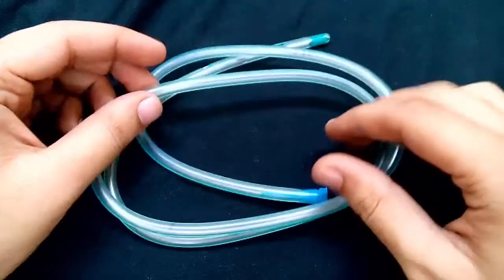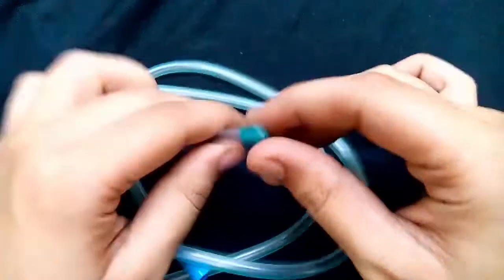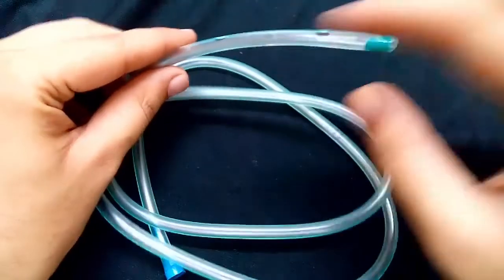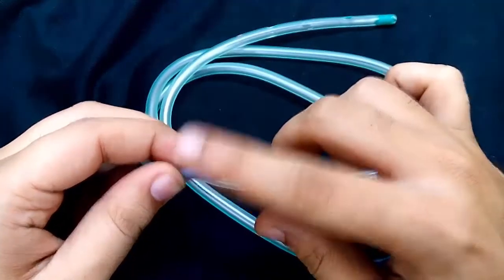There are different parts of the Riles tube. This is the tip of the Riles tube, this is the body, and this is the base of the Riles tube.